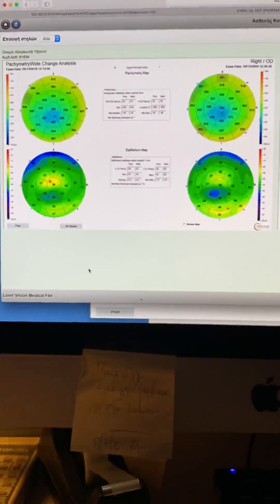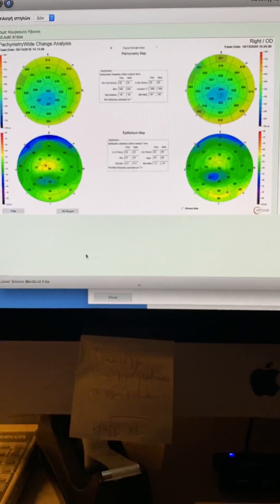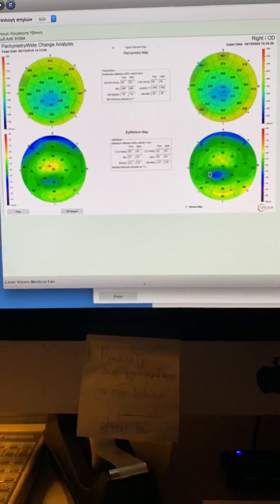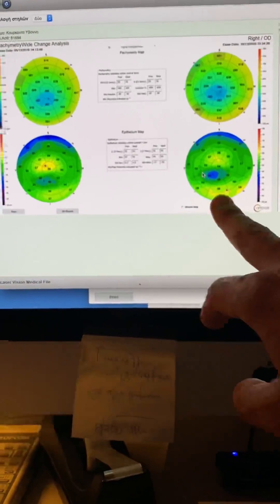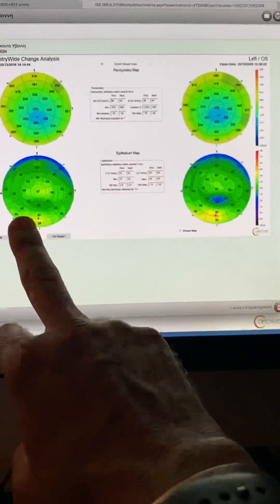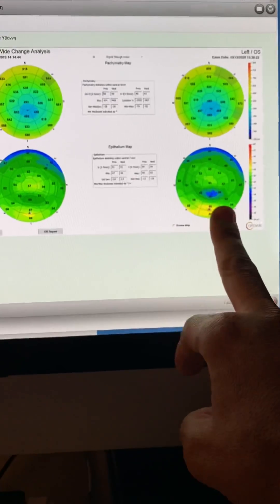Right eye, 19, 2020. Left eye, 19, 2020.